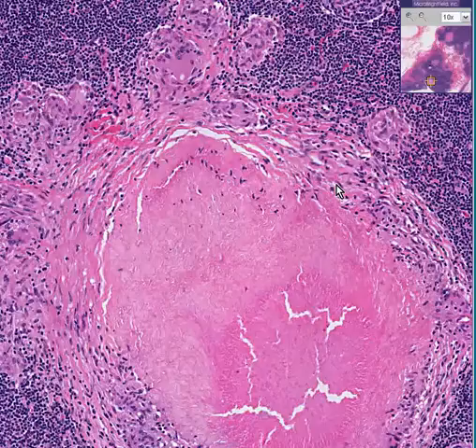Once again, caseating granulomas of tuberculosis within a lymph node, and I thank you very much.